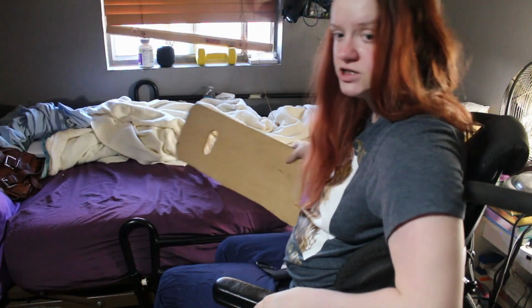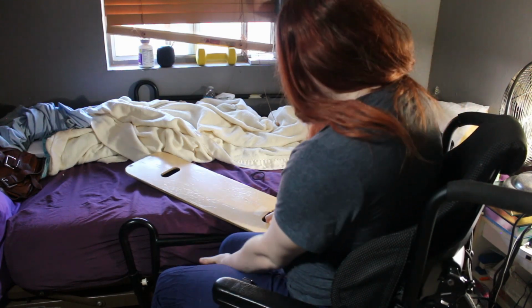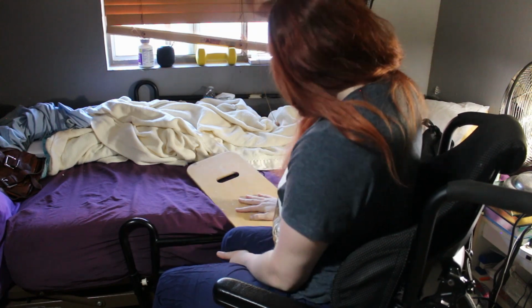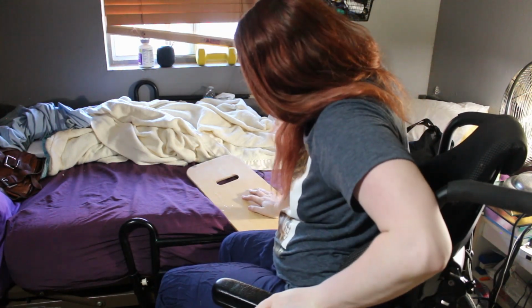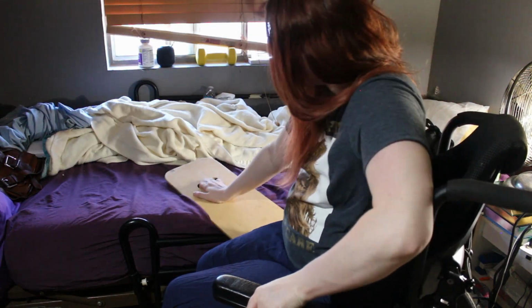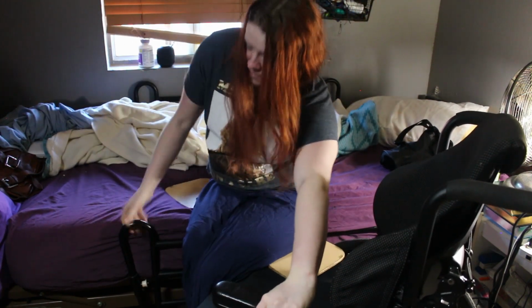So what you do is you take your slide board, and if you have to wear a belt, like I do because of my spasticity, you unbuckle your belt, but then you put the slide board under your leg just enough so that when you scoot, it stays. And so then pretty much what you do is you hold onto this, but watch out because your fingers can pinch. And then you just go over like this.